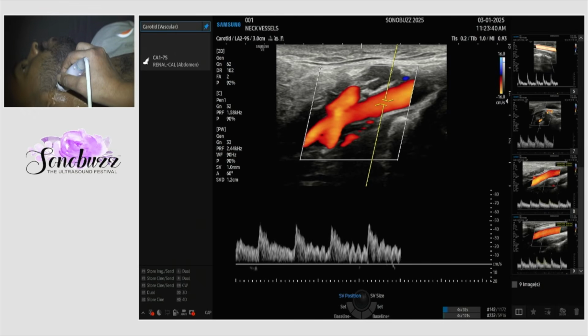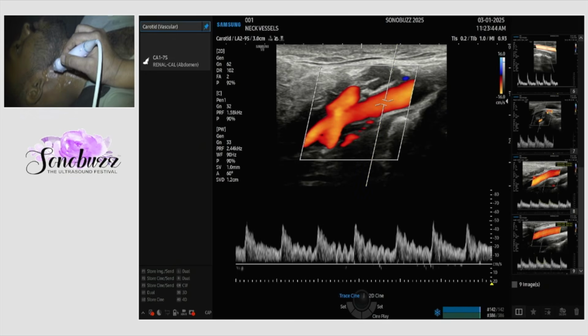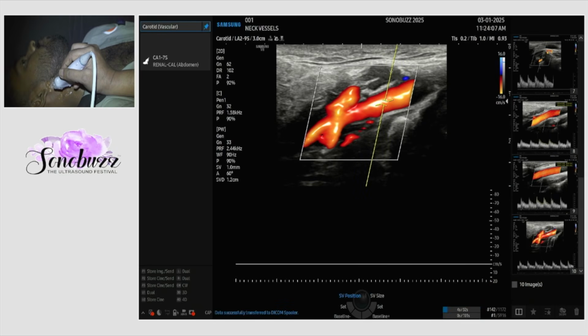So that shows a nice temporal tap, which allows us to think that while I am creating a peripheral resistance by giving multiple taps onto the external carotid artery, it will be reflected into the circulation, and that is why we see this temporal tap. And it is again very specific for the external carotid. Very, very rarely in a thin patient, an ICA tap can sometimes reflect, but overall the flow is different, and we saw the branch. So we recorded this as the external carotid.